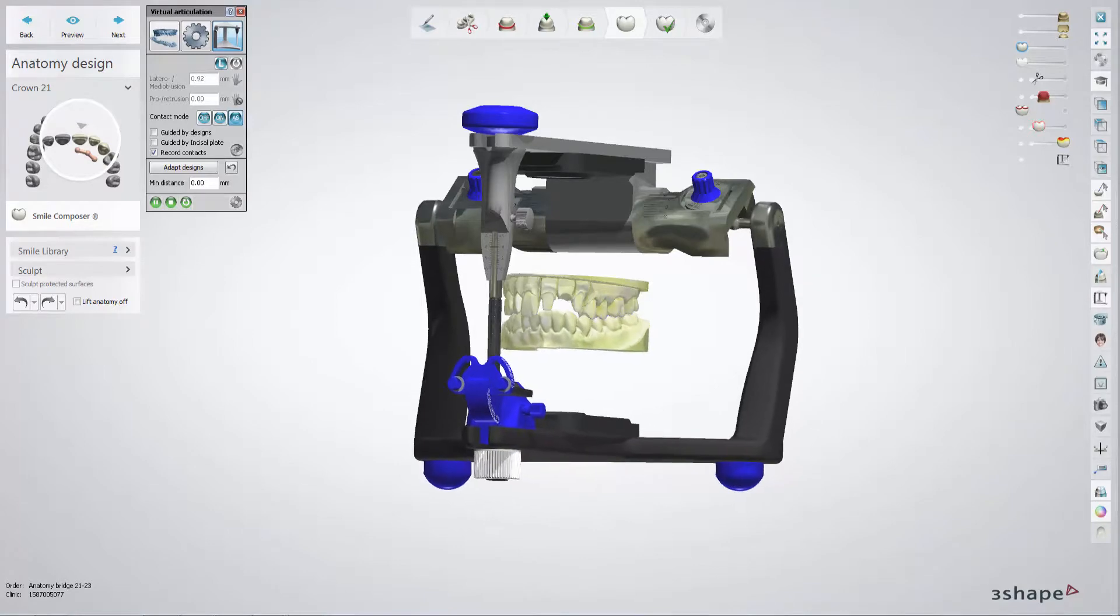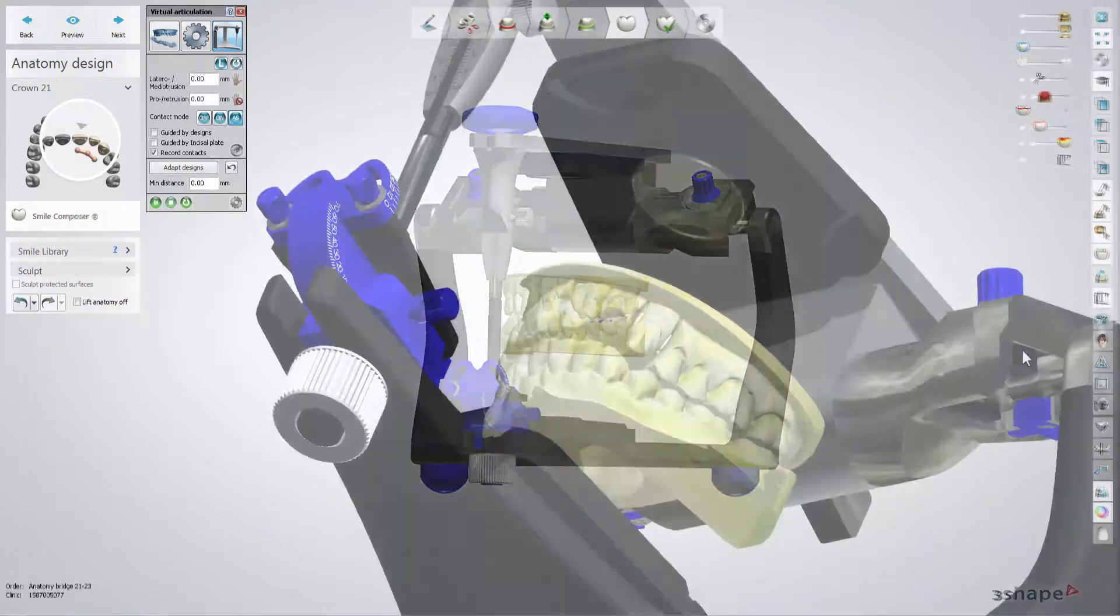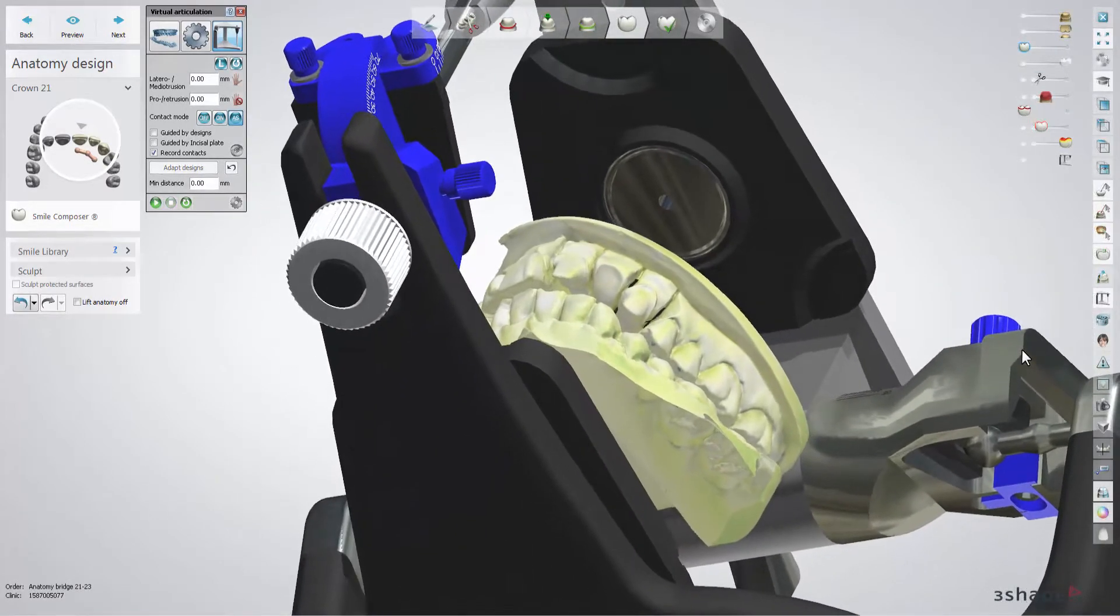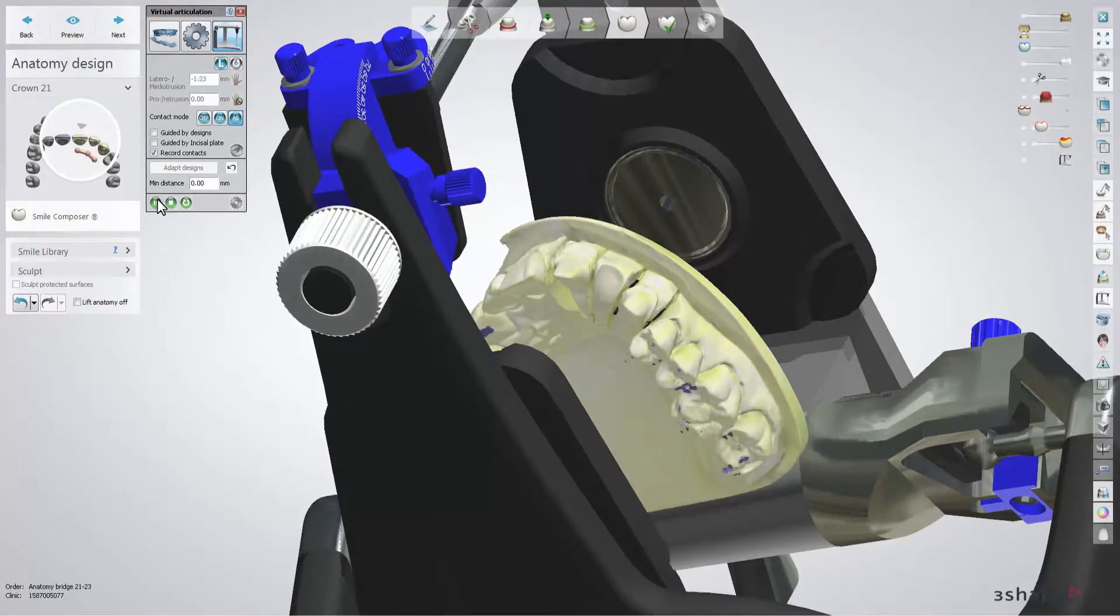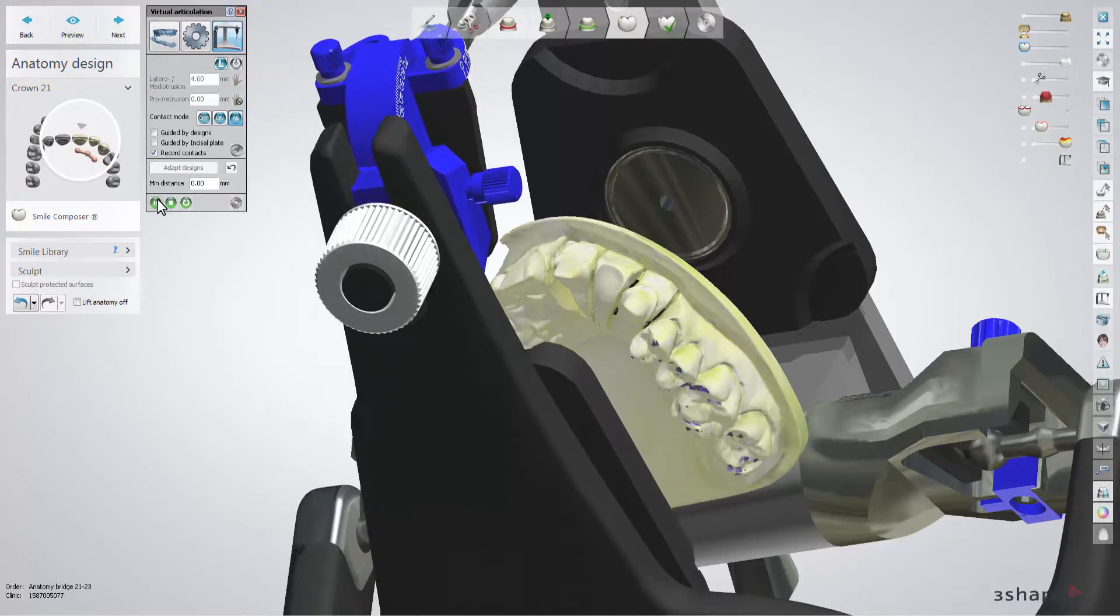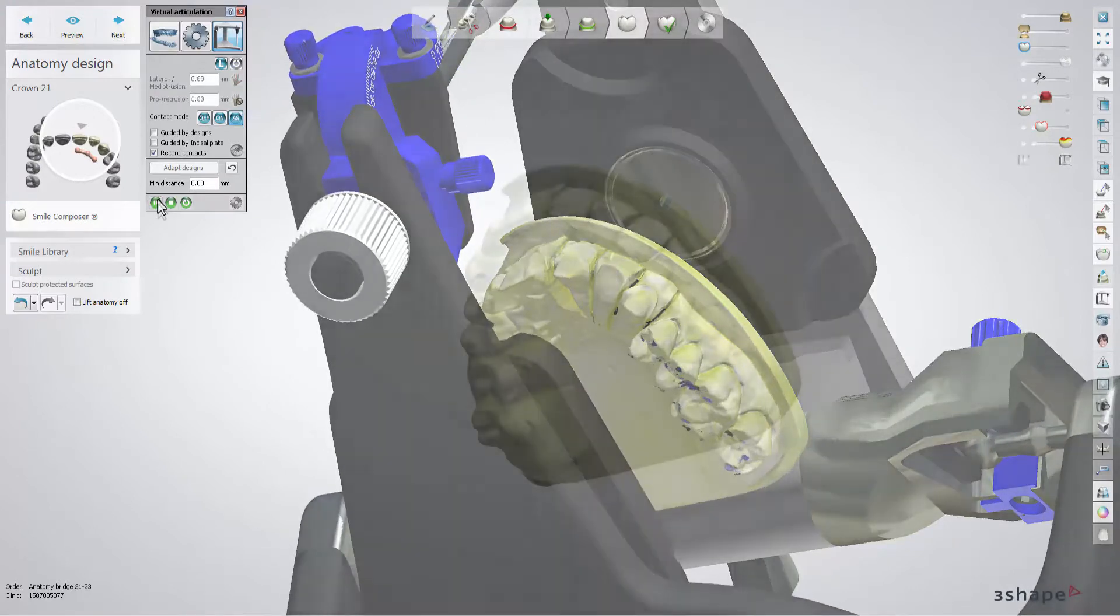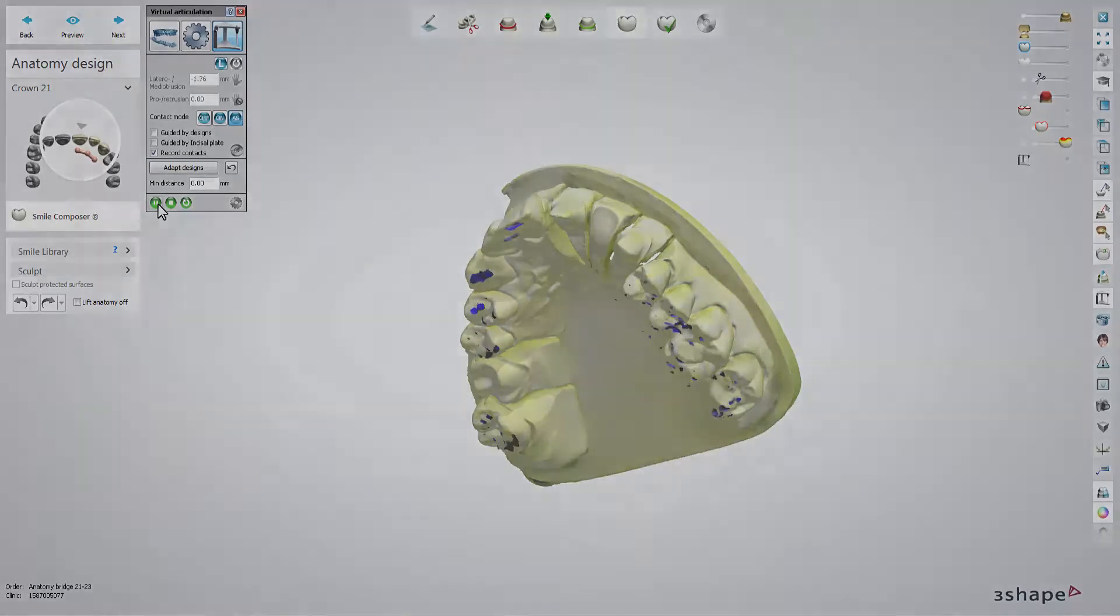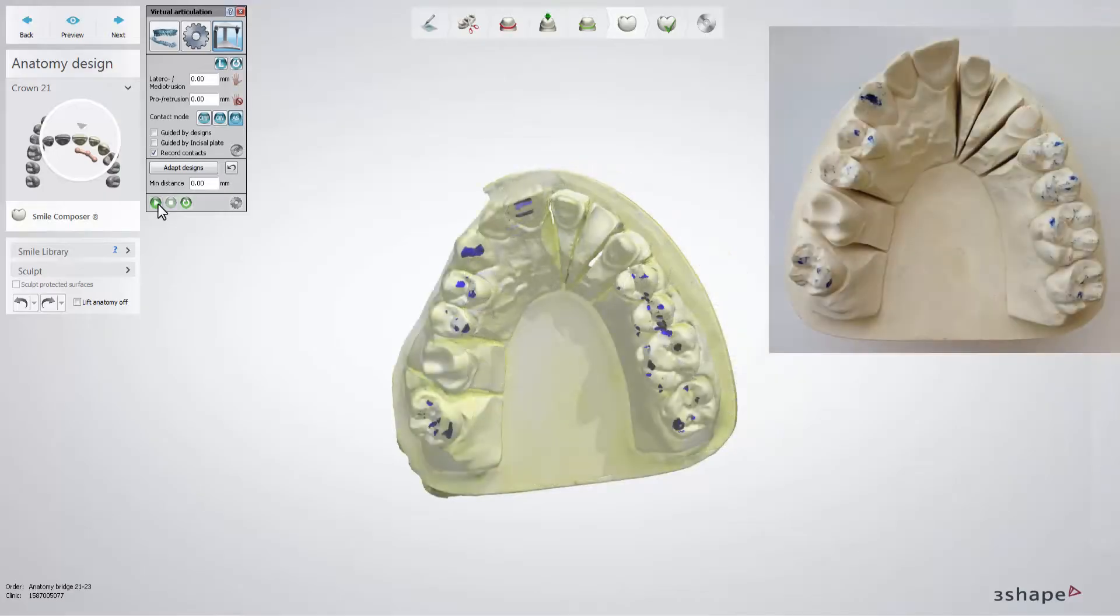When in Dental Designer, you can use the virtual articulator corresponding to the physical one, with the model position transferred. You can use the previously marked occlusal contact points as a reference for checking the transfer precision.